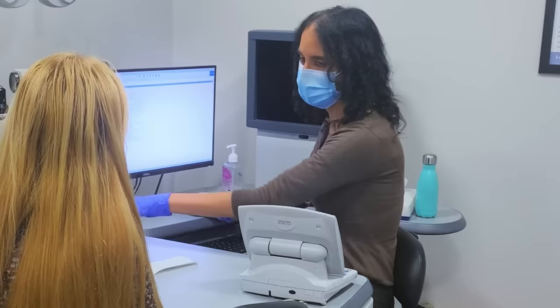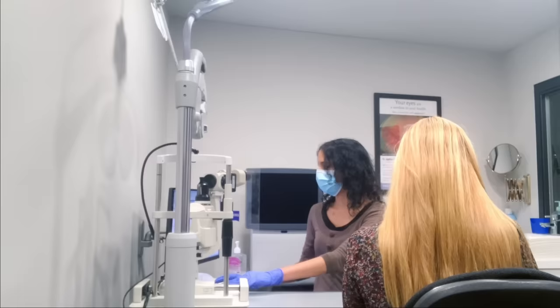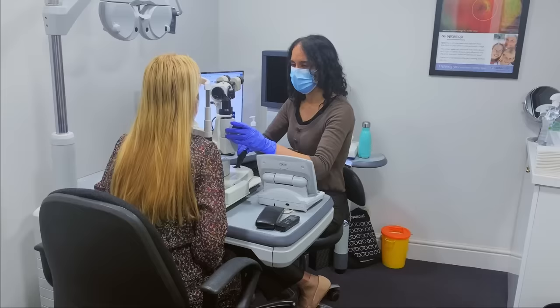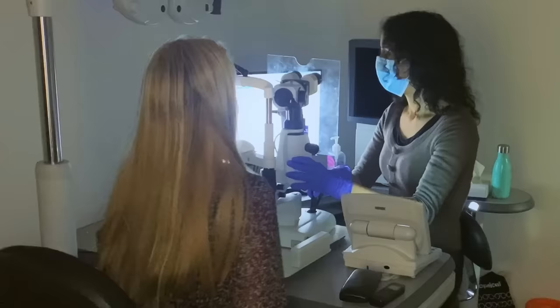Shall I take your glasses? Yes, please. Thank you. Lovely, so I'll slide this machine across. This one would just be a bright light. Good, so chin on the chin rest, thank you, and forehead touching the bar. Is the height okay for you? Yeah. Great, so I'm just going to turn these lights down. But you can stare straight ahead at the screen behind me. Lovely, so chin on, brilliant. So yes, you can stare straight ahead at the chart.